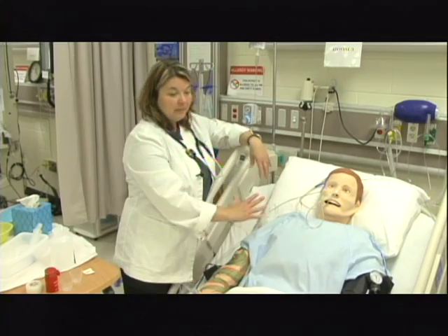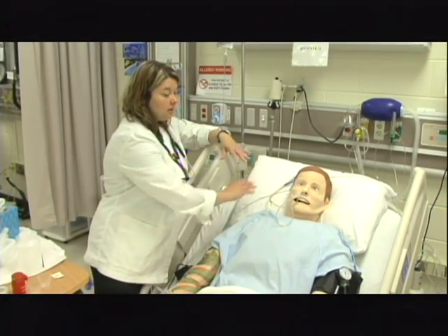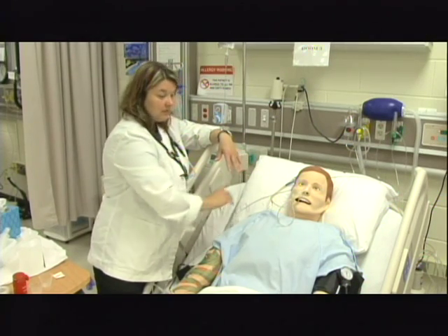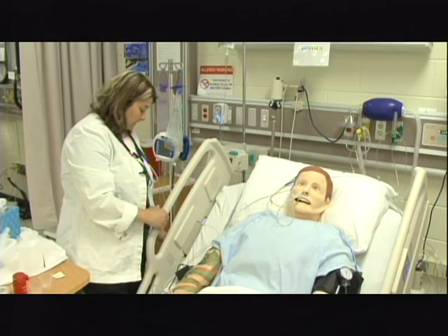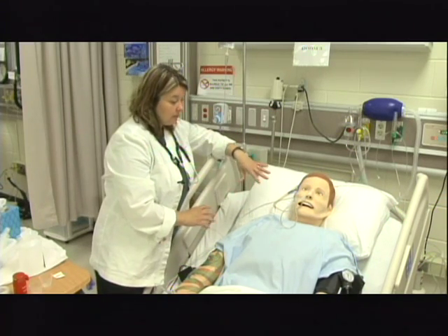Again, I've just given him medications, and he's got an NG tube in, so he is predisposed for aspiration. So normally we would leave him up in at least a semi-Fowler's position. I could lay him back just a little, but again, not too far because he is predisposed for aspiration.